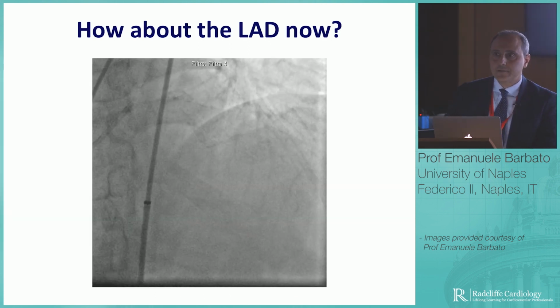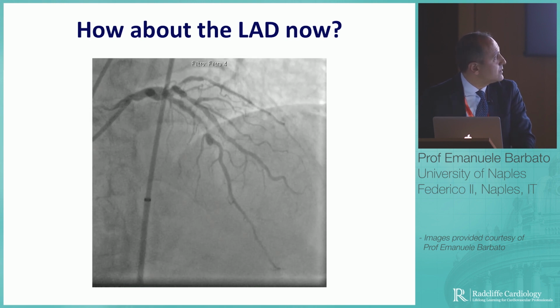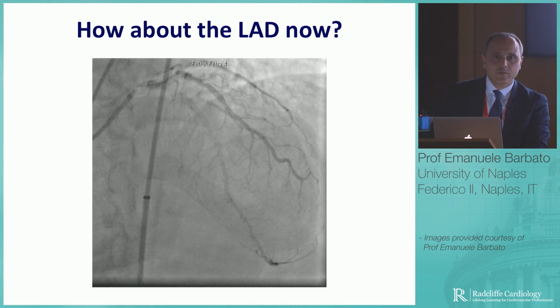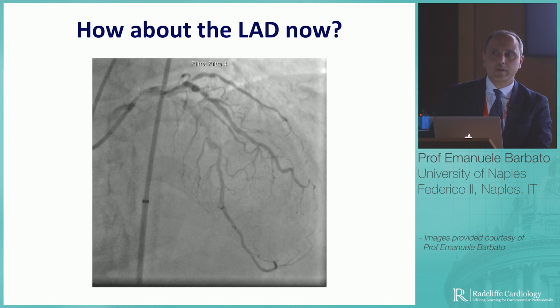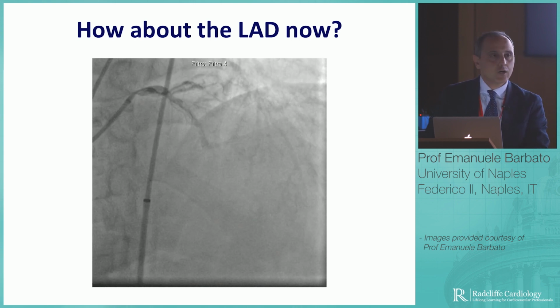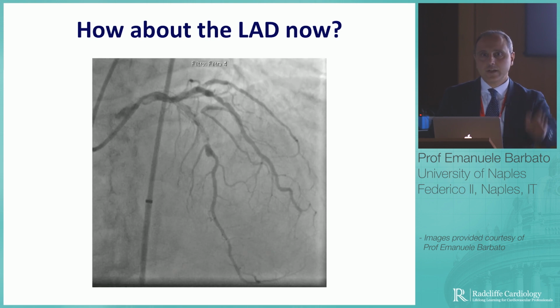We are not yet done. Don't forget the LAD in this patient, so we also have to treat that one. Now the shockwave balloon is open. Who would do shockwave in this vessel as well? Raise hands.